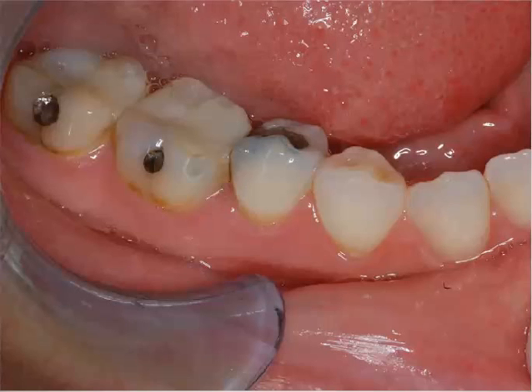So we use that, and then once that is placed and cemented, we're going to go down to tooth number 30. You see here, it's got a large composite, no history of any symptoms. It looks like it was well bonded. There's no sense of any staining, any micro leakage. So that's going to allow us the opportunity to probably keep this in place.